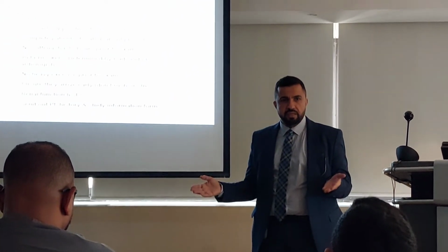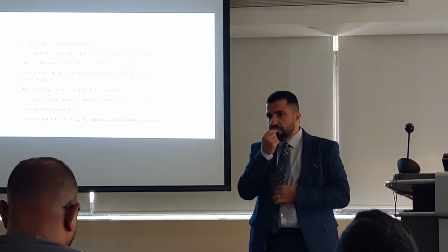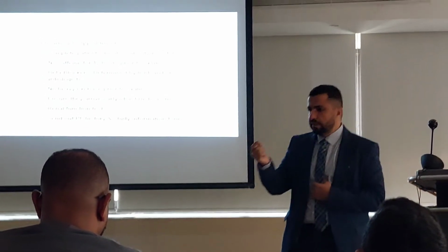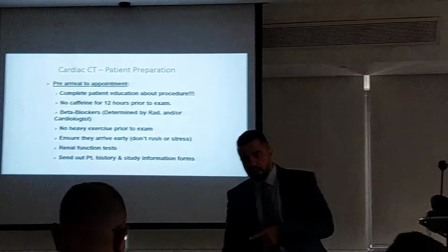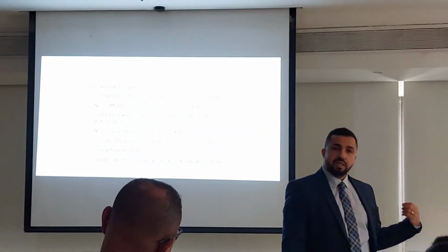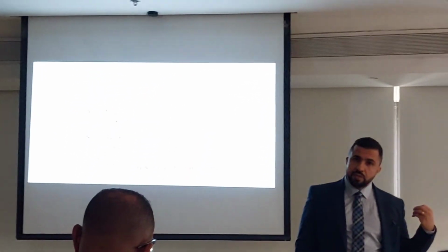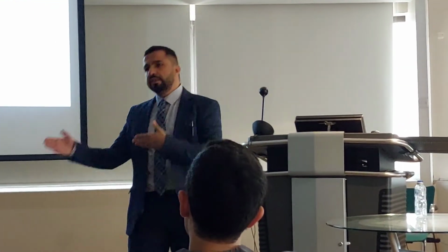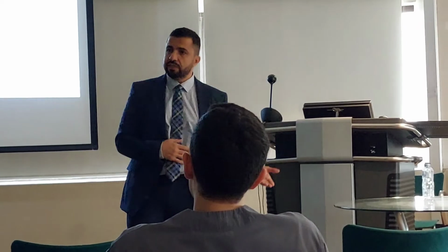They know it's safe. They will give you the metoprolol, 50 milligram or whatever beta blocker you are using. Take these tablets one night before, and in the morning before you come. It's a much better chance to have him controlled. So that's less waiting, less irritating, and a better chance to get a good result.